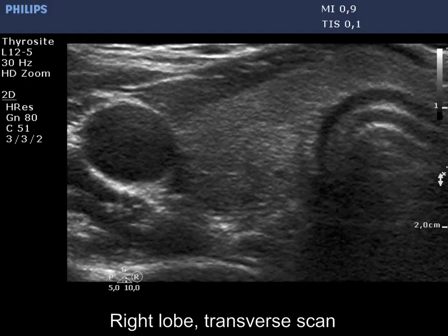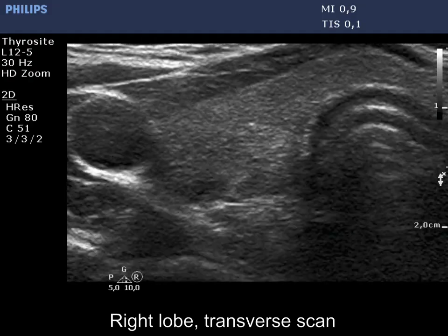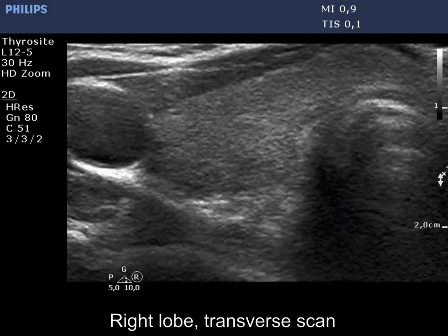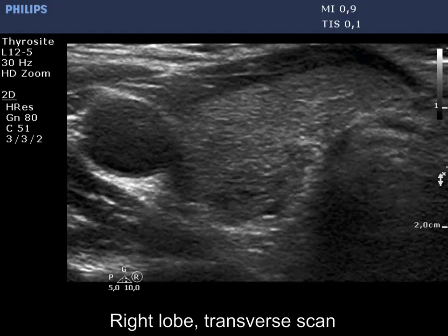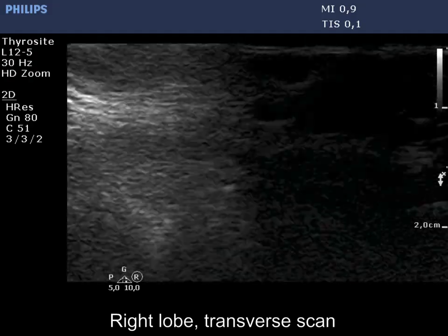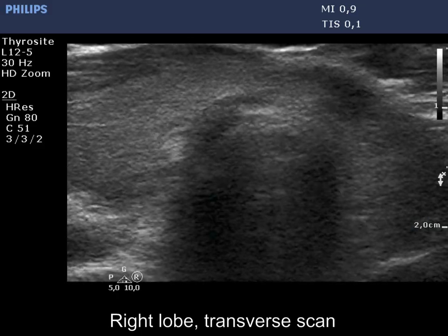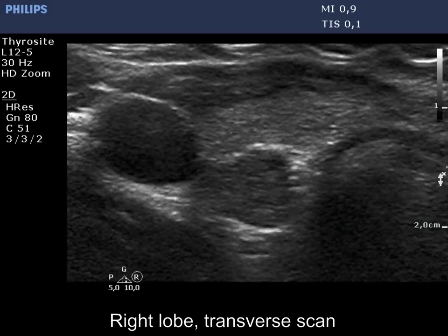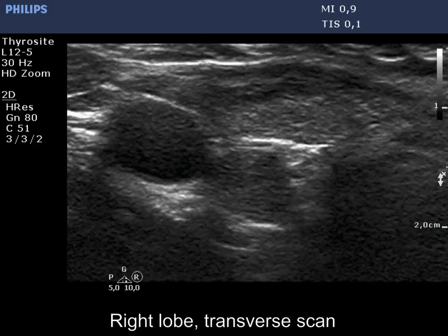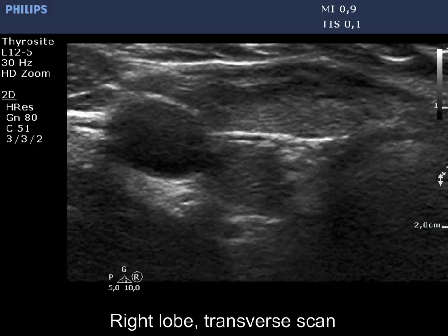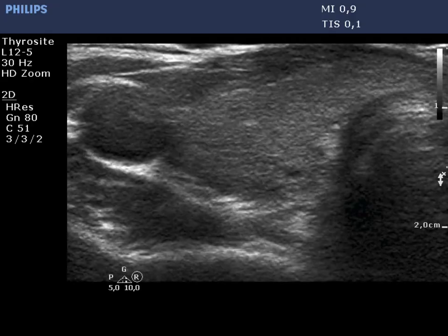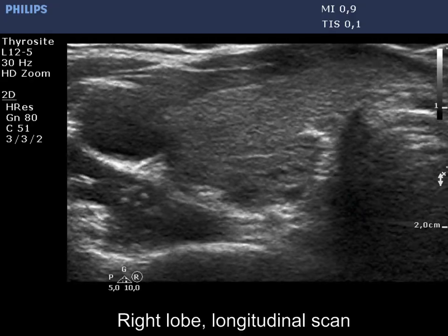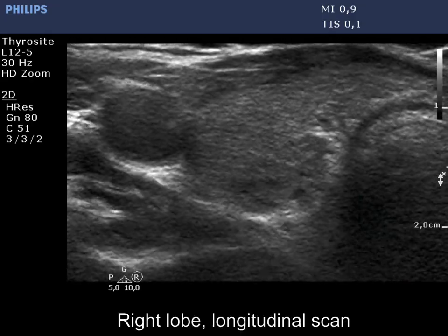Now the enlarged view is presented. In the first part of the exam, the judgment is not problematic. However, this pattern here can raise the possibility of a hypoechoic nodule.